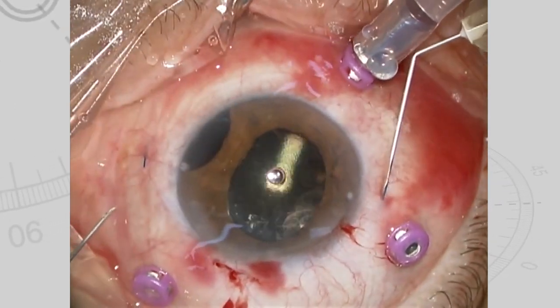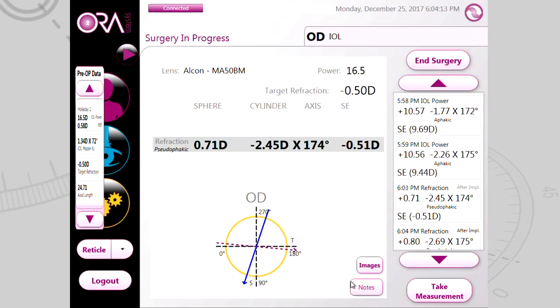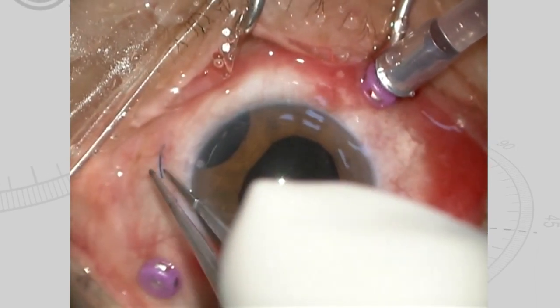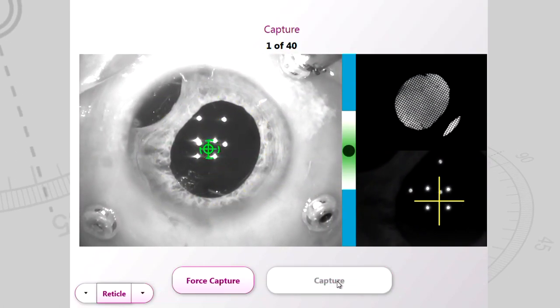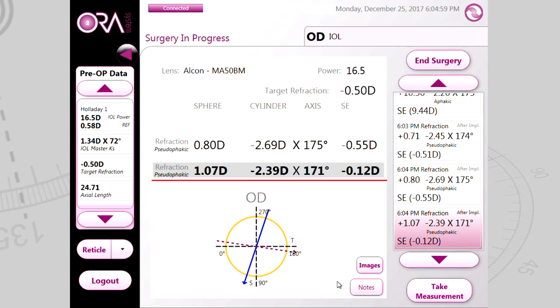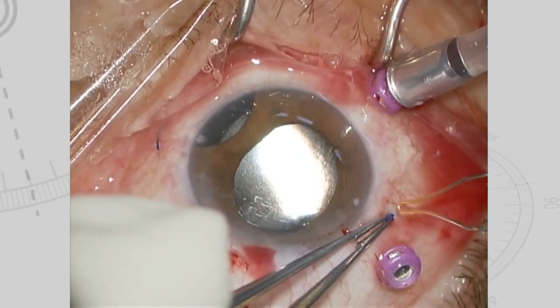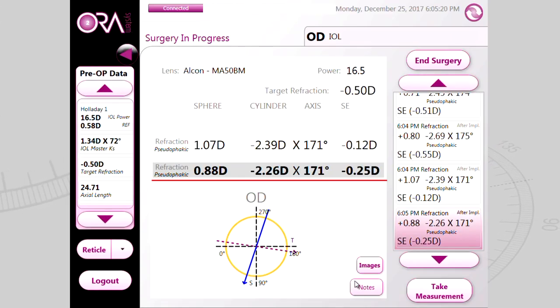With this patient, when the haptics were pulled out at the maximum, the spherical equivalent was minus 0.55 diopters, and when pressed inward at the maximum, it was minus 0.12 diopters. Since the target refraction was minus 0.5 diopters, to make sure that the IOL's optical part should be shifted to the front and the eyes become myopic, we cut the tip of the haptics by 1.5 millimeters, then created a flange and anchored it. The spherical equivalent after fixation came to be minus 0.25 diopters.